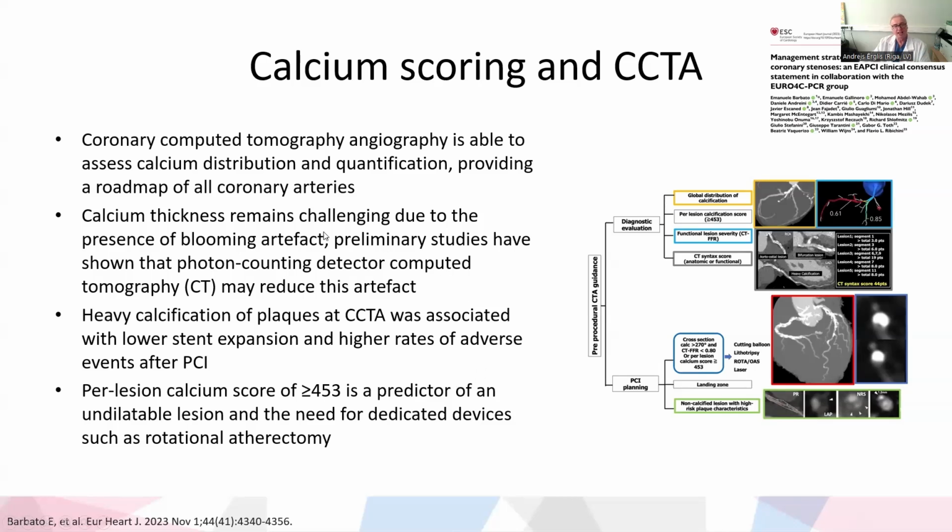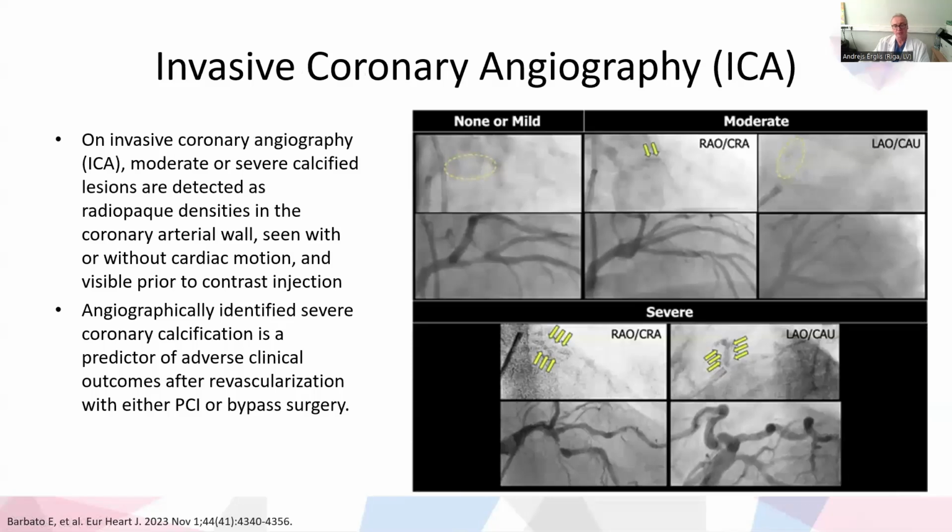patient preparation. I'd say one thing: of course, in the meantime with CT scan, computed tomography, sometimes because of these blooming artifacts we can't really define and see what is inside. But what we are looking for, and this is the next decade for sure, is photon counting CT scan, and I'd say there will again be a revolution in diagnostics.